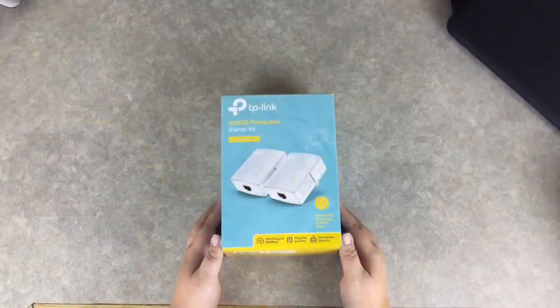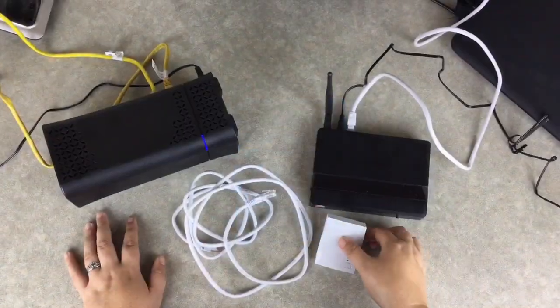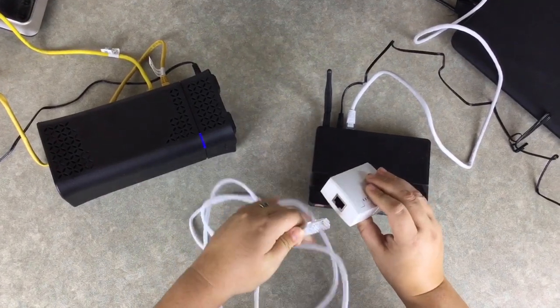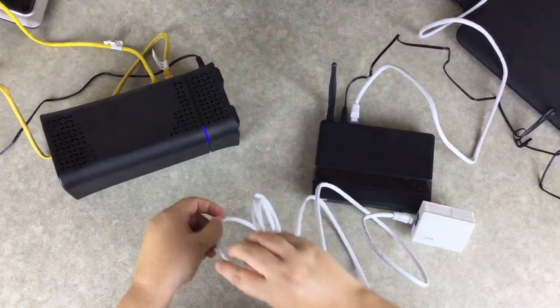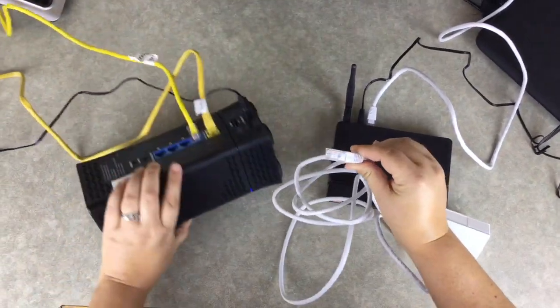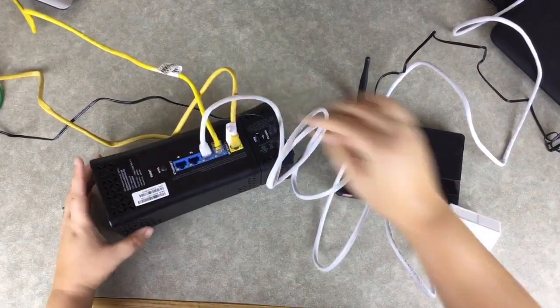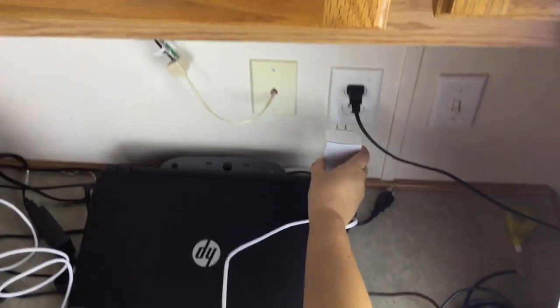If your treatment area is more than 30 feet away from your home router, you will receive wireless extenders. If you receive these, you will forgo the previous steps. First, we will start by plugging an ethernet cable into one of the white boxes. Plug the other end of the ethernet cable into an available LAN port on your home router. Now plug the white box into an electrical outlet.